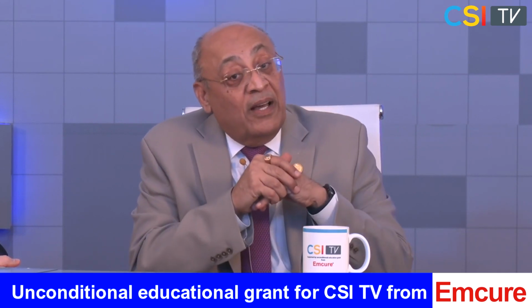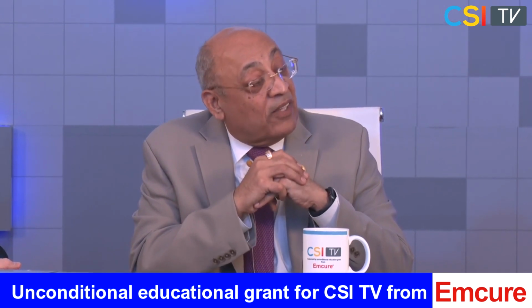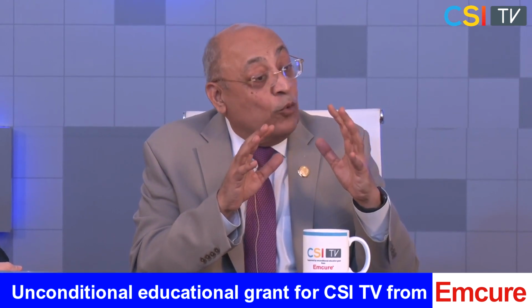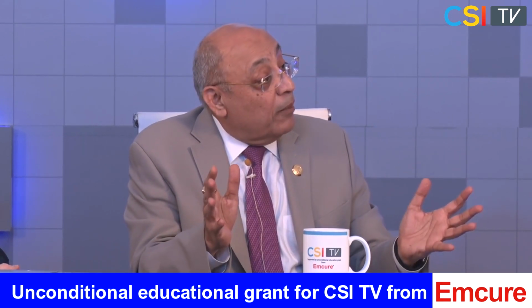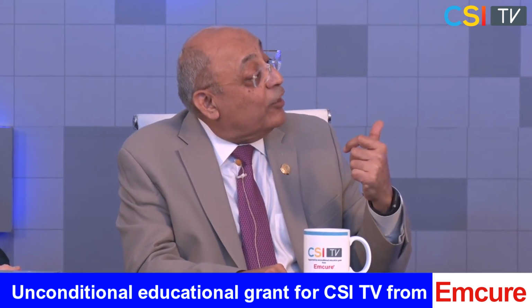So basically, are we going to be able to say that FFR gives us an outstanding negative predictive value? Should we be able to exclude those patients who are likely to do very well, regardless of the amount of stenosis, on the optimal medical therapy, proving what the COURAGE and the BARI 2D trials showed us?